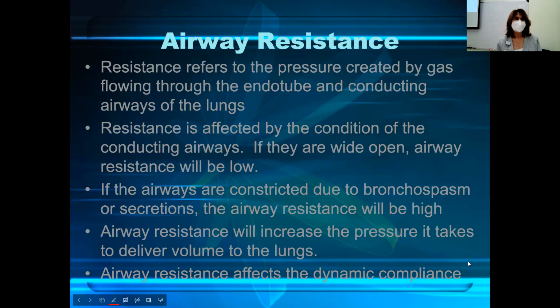Okay, now we're going to talk about airway resistance, and that's the difference in the peak pressure and the plateau pressure. I was telling you the further apart those two numbers are, the more airway resistance you have. So airway resistance, what does it say? Resistance refers to the pressure created by gas flowing through the endotube and conducting airways of the lungs.